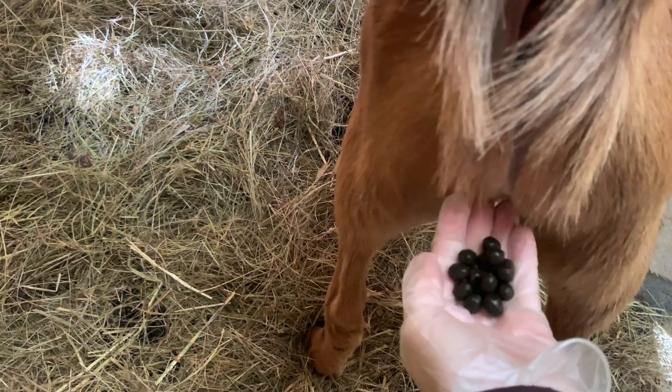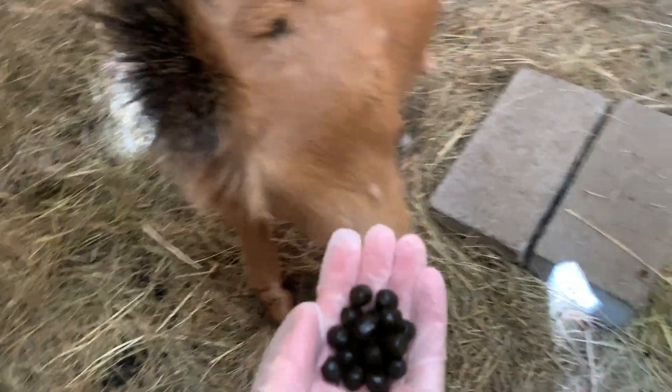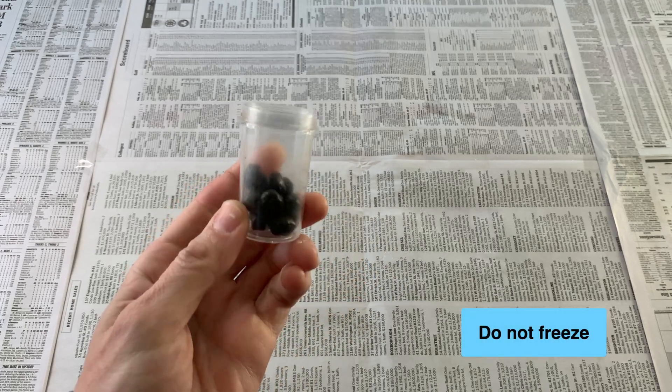Ideally, you'll collect straight from the source before the pellets hit the ground, to minimize dirt and other debris from contaminating your sample. If you can't get to testing right away, you can store your samples in the fridge for a few days if needed.